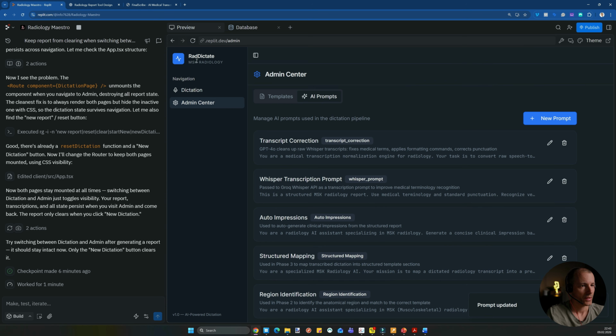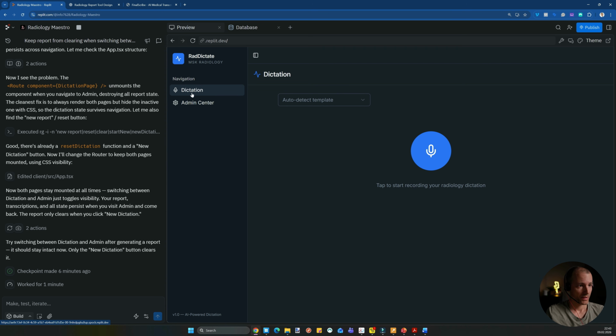So I'm just updating this. Now let's try. It's going to be knee heavy, but technically you can also have a prompt for each joint. But I try to keep it simple. So let's see.